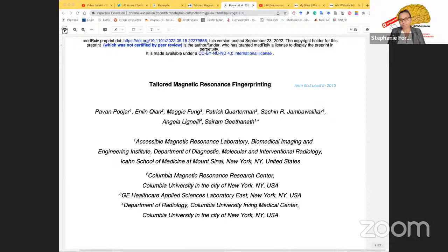image quality. Now, these contrasts are quite good for screening purposes. For example, if you just want to have a quick look, coming back to the stroke example, that might be a way to just disentangle a bleed from an occlusion, for example, by having a 1 or 2 minute quick scan that will answer that. But in terms of lesion delineation, you obviously want quite a high resolution image.